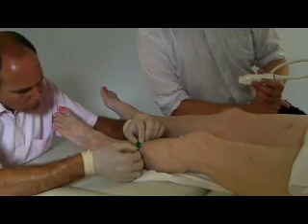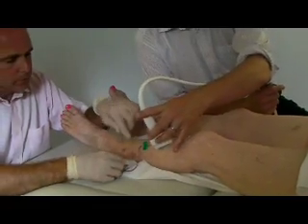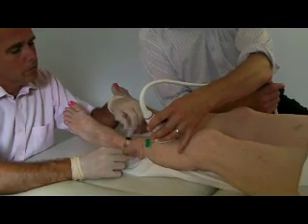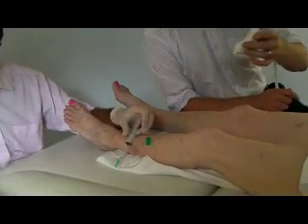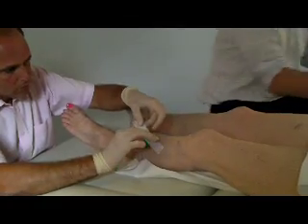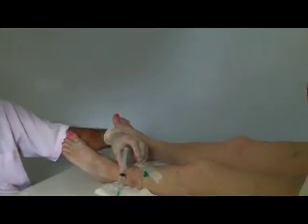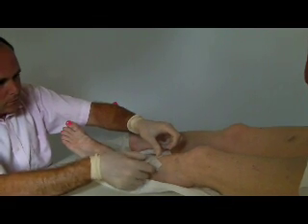This is a very careful procedure as the needle can become displaced. Once again the doctor will use the salty water to check it's in the correct place and use the ultrasound to make sure it's flowing through the vein. This is very important as the chemical used for the foam sclerotherapy can irritate the skin if it's placed outside of the vein. As before, the needle is secured into place using some sticky tape so that the needle does not come out as the procedure commences.